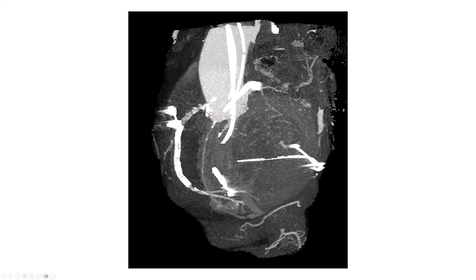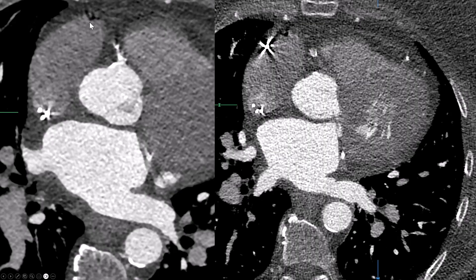We see there is significant calcification of the ostium. There is a previous stent on the right coronary artery, and there is a bifurcation of the posterolateral and the PDA distally. These are the axial views, and once again it's a FLAS occlusion. We do have some calcification into the right coronary artery that originates at about 12 o'clock, so it is an anterior take-off right coronary artery with some calcification further down into the vessel.